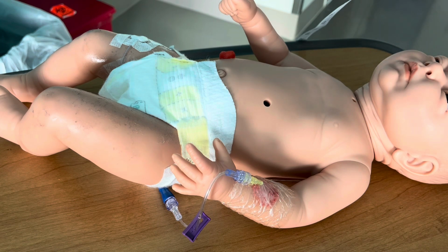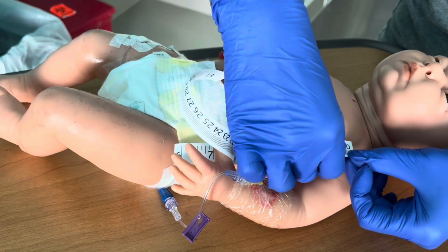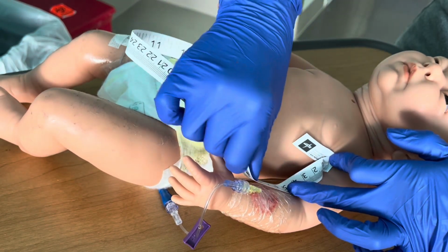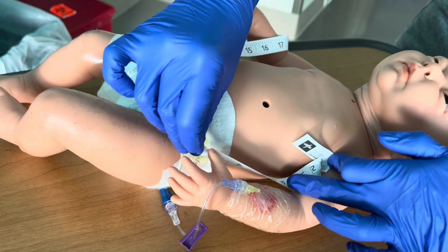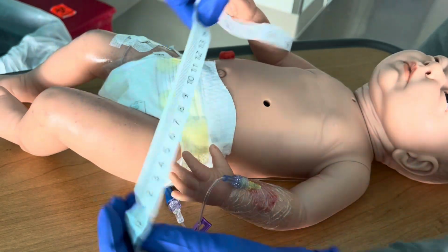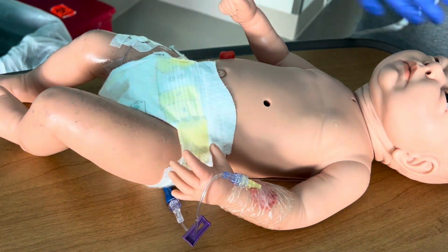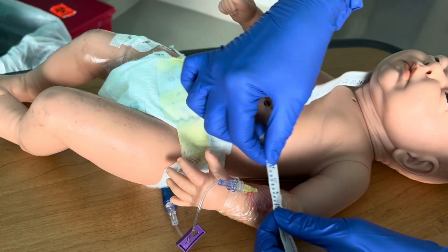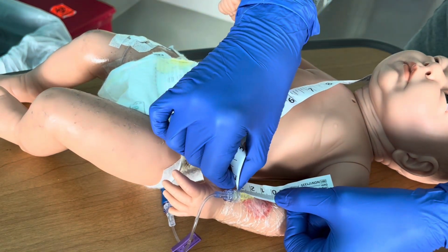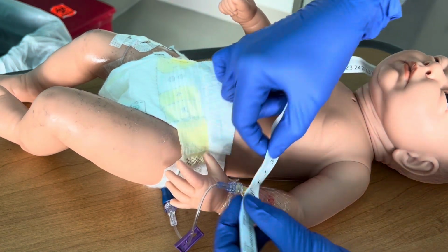When measuring, the measurements are in centimeters, and you measure from the axilla on the inside of the arm to the third fingertip, and you get your measurement, which looks about 15 centimeters. And we measure the infiltrate, whatever the longest measurement is. It could be the width or the length.